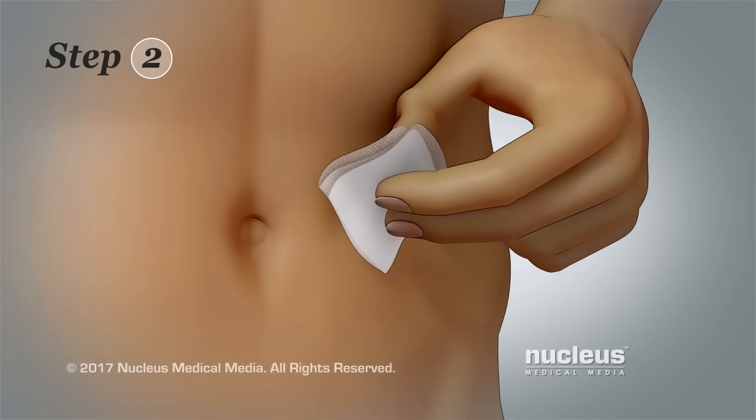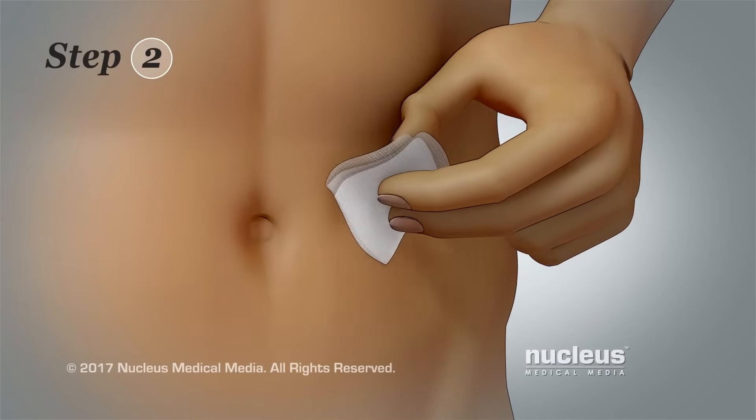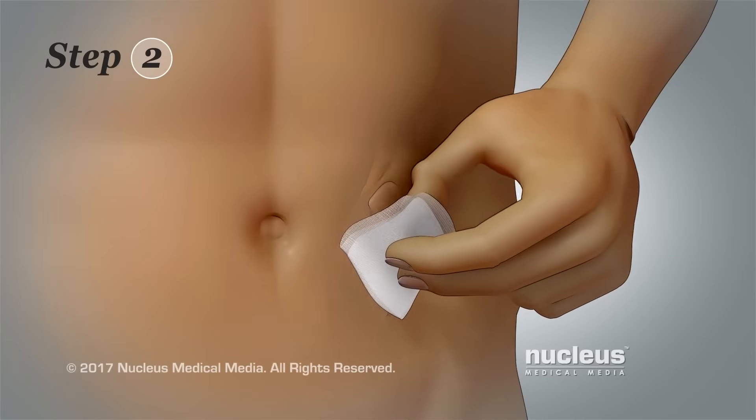Step 2. Clean the skin over the injection site by rubbing with an alcohol wipe in a circular motion.